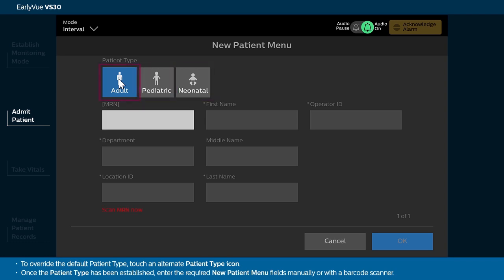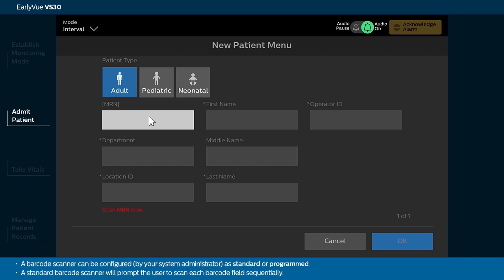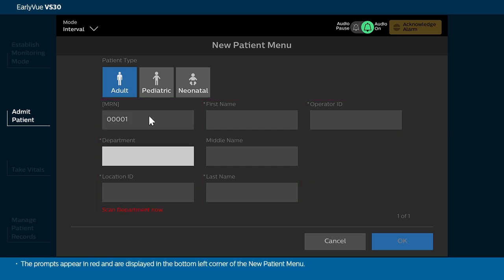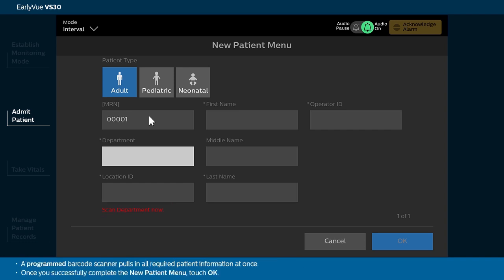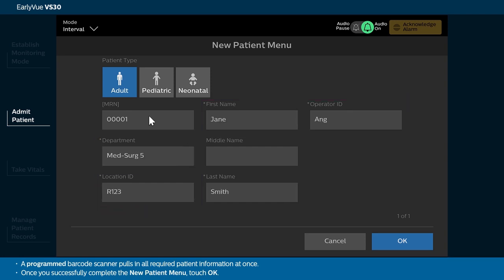Once the patient type has been established, enter the required New Patient menu fields manually or with a barcode scanner. A barcode scanner can be configured by your system administrator as standard or programmed. A standard barcode scanner will prompt the user to scan each barcode field sequentially. The prompts appear in red and are displayed in the bottom left corner of the New Patient menu.